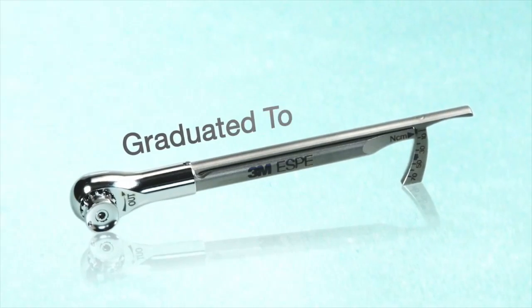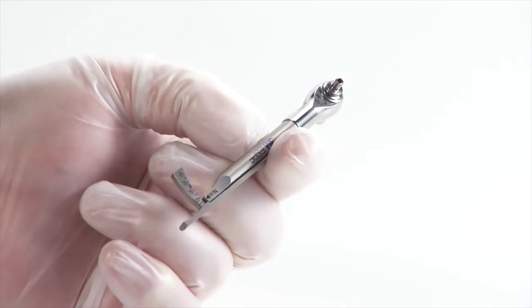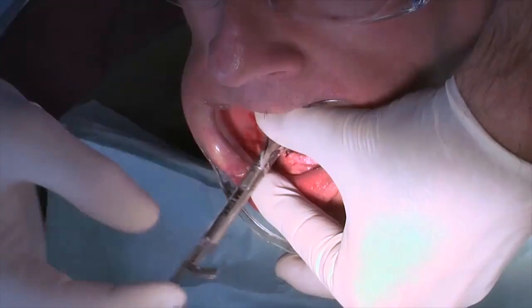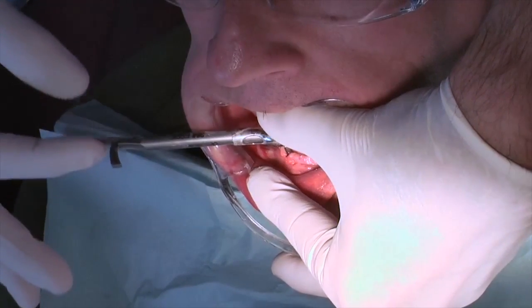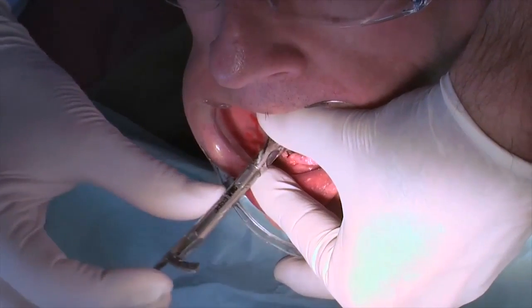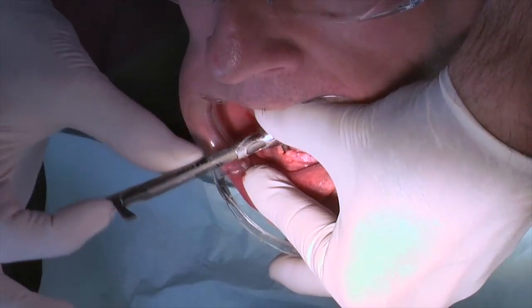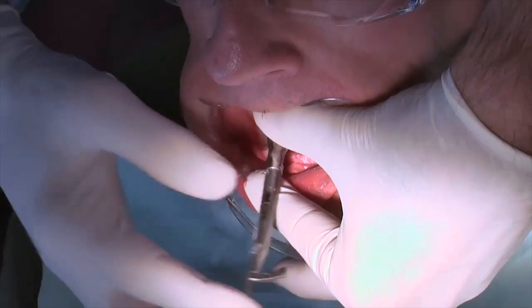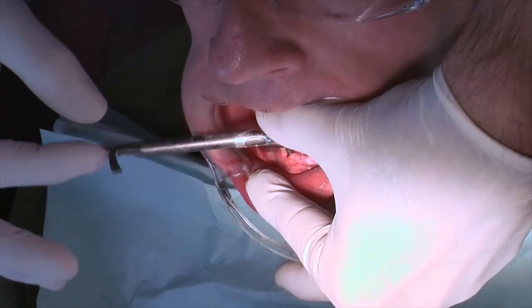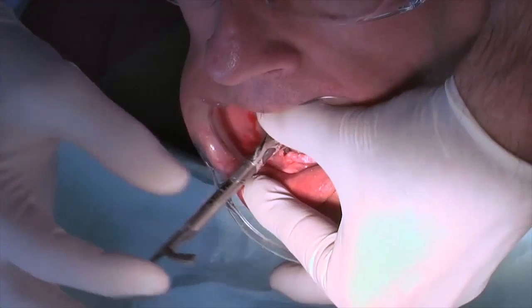Use the graduated torque wrench to advance the implant fully into the bone. Position the wrench with the arrow on top pointing clockwise and make slow, careful small turns to advance the implant until the abutment head is protruding slightly from the gingival tissue with no neck or thread portion visible. Even if you can advance the implant with the winged thumb wrench, the graduated torque wrench should be used for the last few turns to have an accurate record of implant stability at final placement.